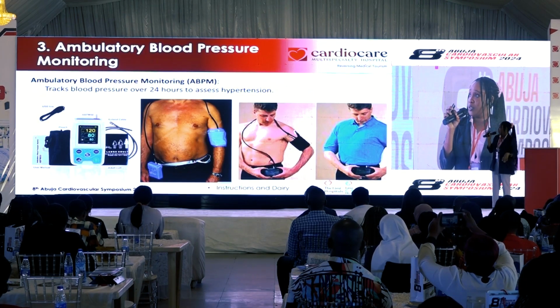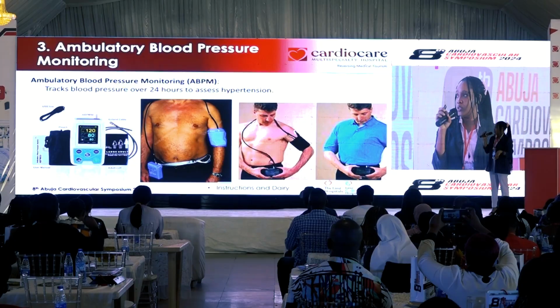So the next procedure I'll be talking about is the ambulatory blood pressure monitor. This is a device that we use for patients. It monitors their blood pressure for 24 hours. So it's used to assess the night dipping pattern and also the day pattern. Okay, so they fix it for 24 hours.